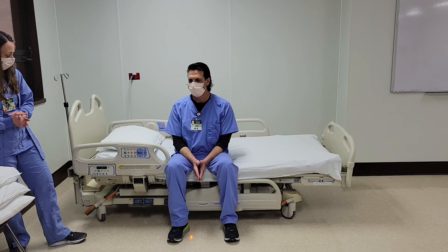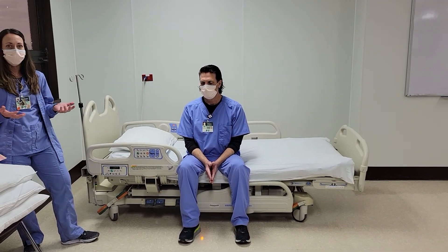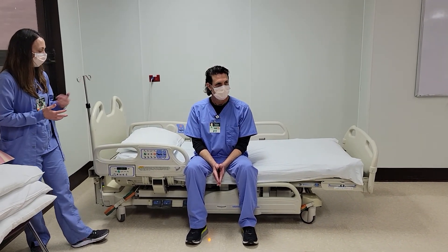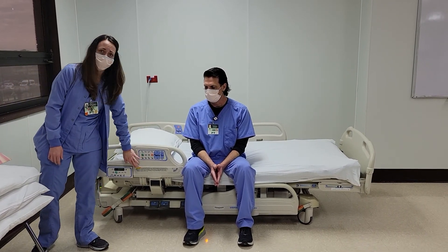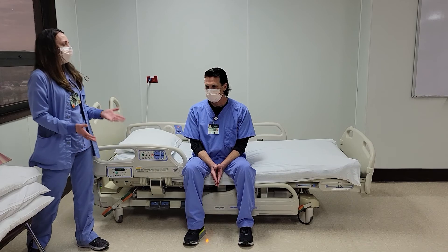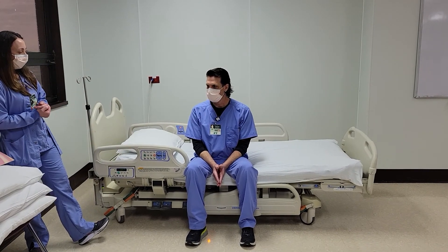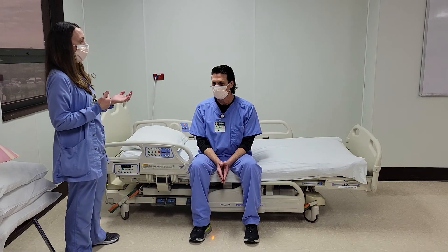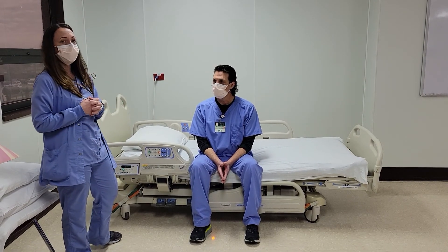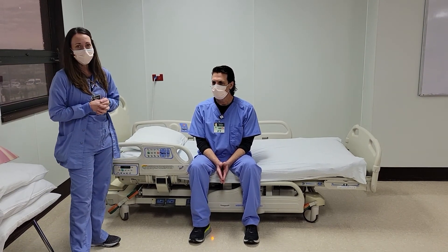A couple things to keep in mind when you're weighing your patient: zero out the bed with the same amount of sheets each time. The instructions for the bed alarm are also written on the bed rail. A side note is weight capacity — there is a weight limit for the bed including the patient, the mattress, and everything that's on the bed. It's 551 pounds.